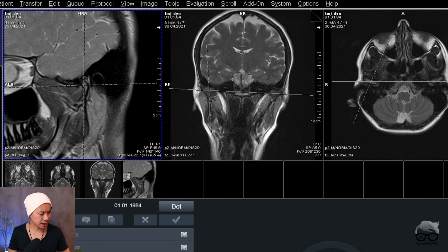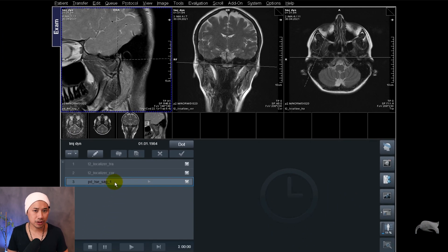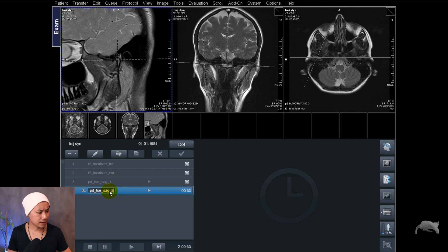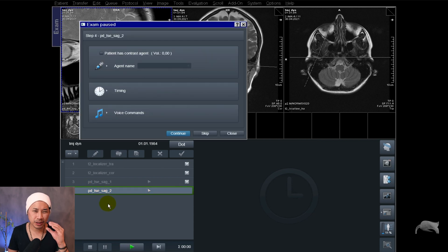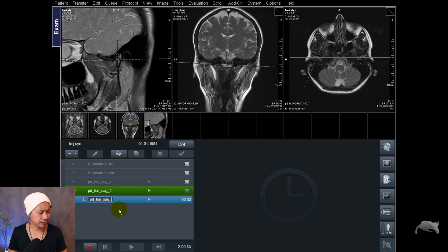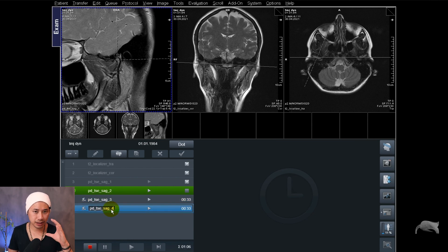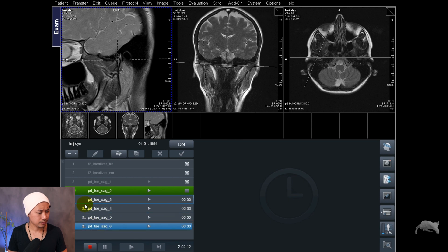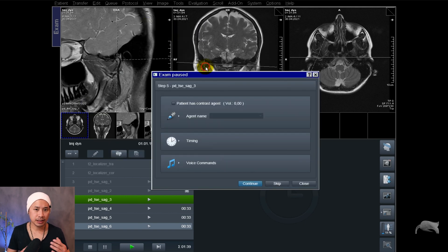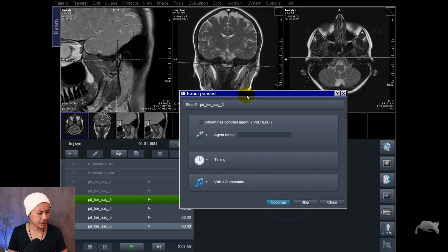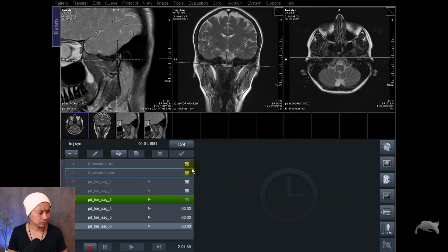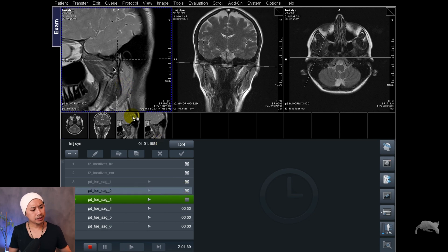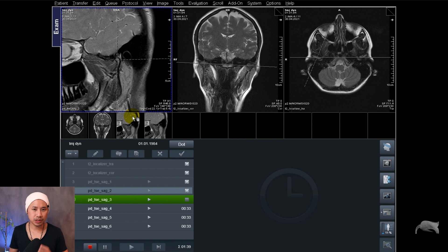What I'm going to do next is drag the sequence down, copy that one, and call it number two. Now I'm going to ask the patient to open the mouth a little bit and stay there, then do the next scan. I'll make ready many more — number three, four, five, six — depending on how far the patient can open the mouth. So now this one is done, I'm telling the patient to open the mouth a little bit more and do another scan of 33 seconds. The thing is I'm going to scan all the sequences with the mouth opening more and more to the max. Then I'm going to do some post-processing — let me show you.